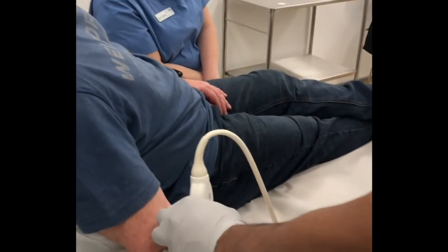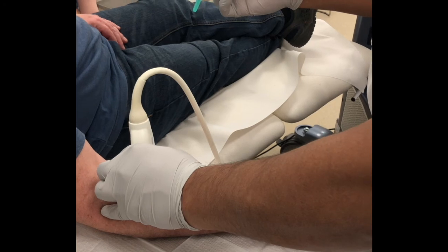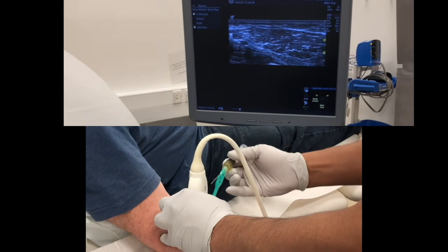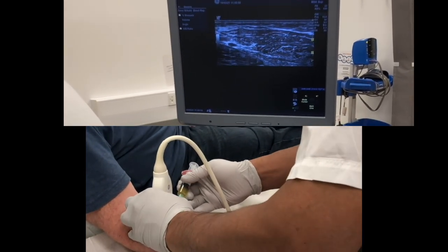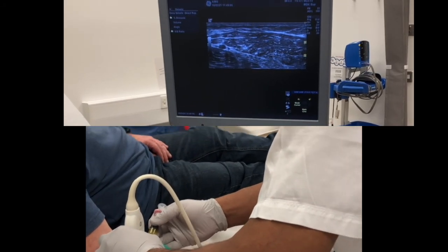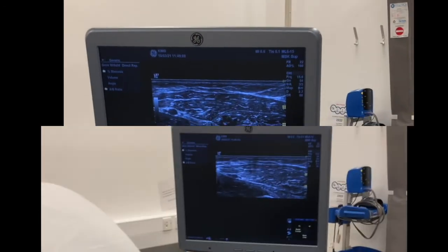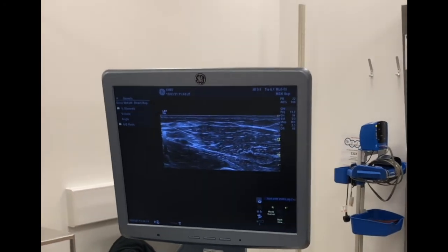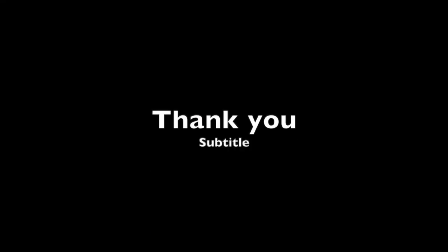The probe is cleaned with antiseptic solution. With the syringe loaded with PRP, I locate the needle using the ultrasound probe to the area where it needs to go, supinating and rotating the forearm to get into the right position. You can see the needle going through near the distal biceps.